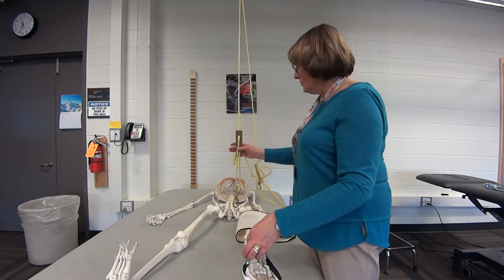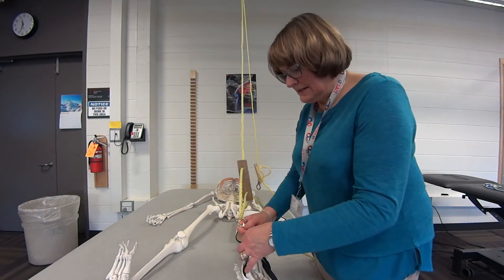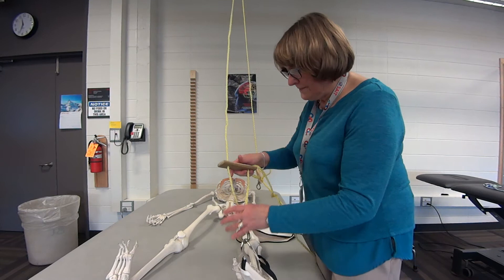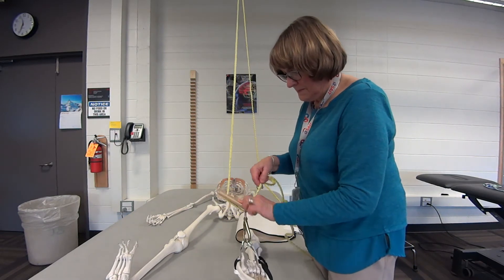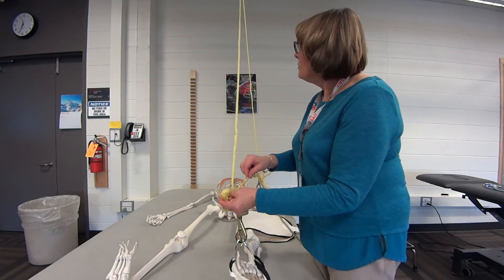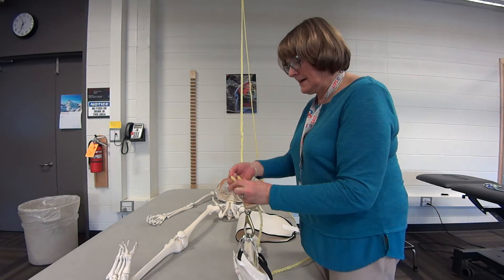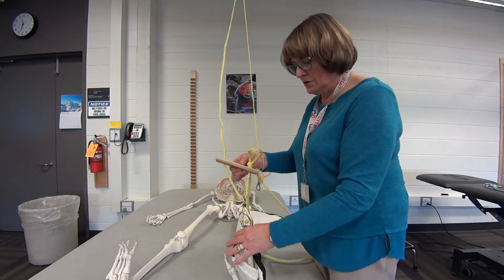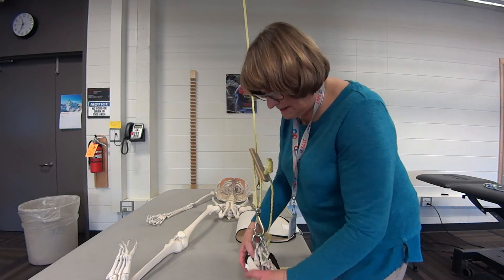Slide this down and hook it on. You just want to take up the slack — you're not lifting the leg, just taking the slack off so it's nicely supported.